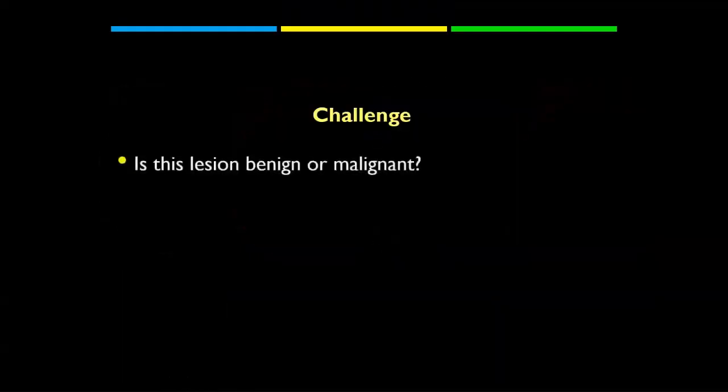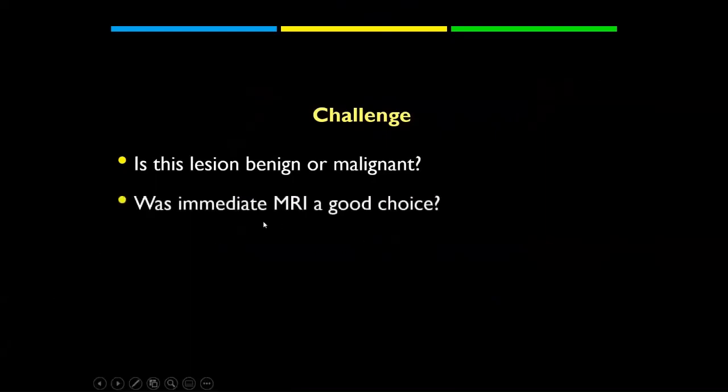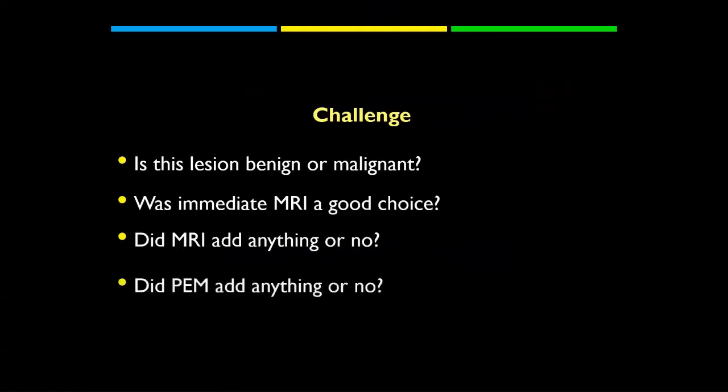So the challenge in this case is: is it benign or malignant? Was immediate MRI a good choice or not? Did MRI add anything or not? And did PEM add anything or not?